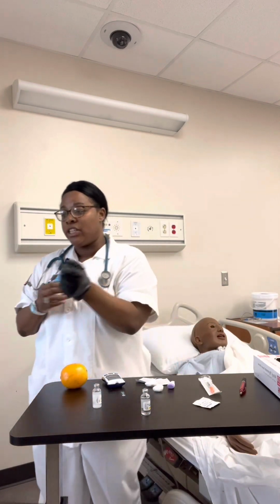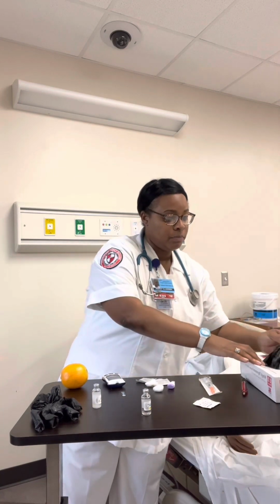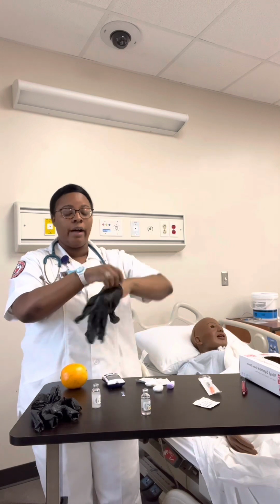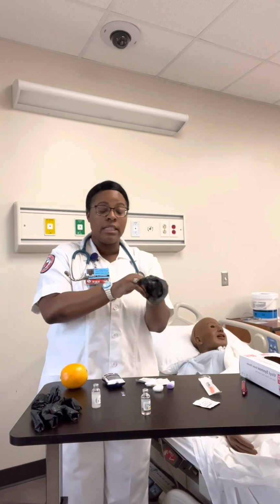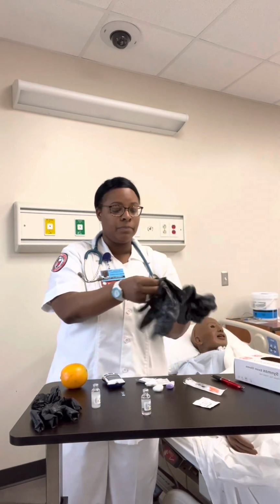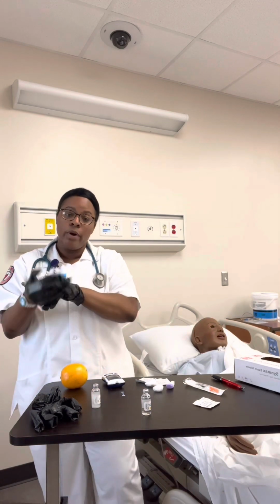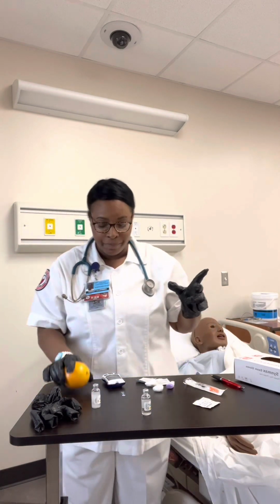I would remove my gloves and perform hand hygiene. I would explain the procedure to the patient and don clean gloves. Administering insulin, the sites that you can administer insulin, you can do the abdomen, the backs of the arms, or the thighs. We're going to be demonstrating using our orange here.